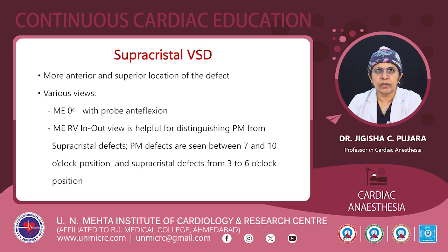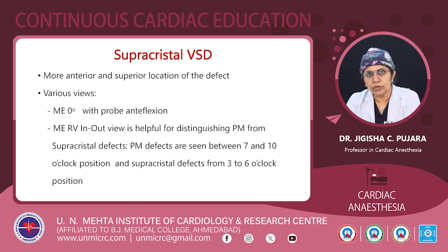Another is the supracristal VSD, a more anterior and superior location of the defect. Views used for looking at the supracristal VSD are mid-esophageal 0 degree with probe anteflexion, and the mid-esophageal right ventricular inflow-outflow view, which is helpful to distinguish the perimembranous from the supracristal defect. Perimembranous defects are seen between the 7 and 10 o'clock position, while the supracristal defect can be seen at 3 o'clock to 6 o'clock. In this inflow-outflow view, slight withdrawal of the probe with anteflexion is very helpful to distinguish the supracristal and perimembranous VSD.